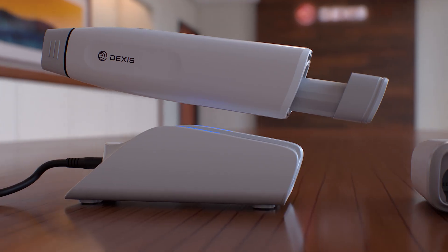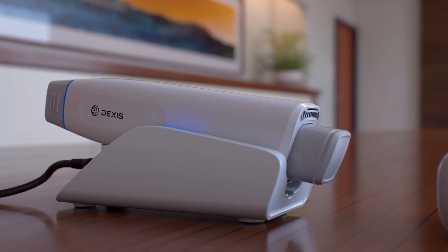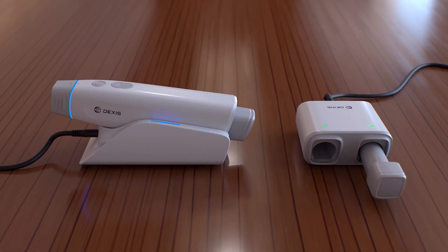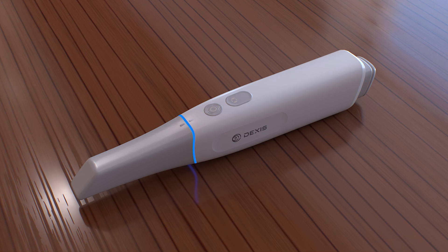The rechargeable battery provides extended operation throughout your workday. Charge it directly in the handpiece while docked, or charge spare batteries separately using the included battery charger. When set down or idle for 20 seconds, the scanner automatically enters standby mode to preserve power. A quick press of the power button wakes it up instantly.